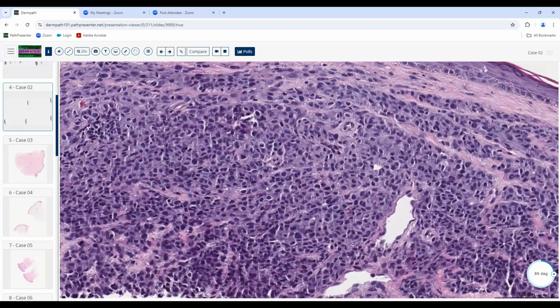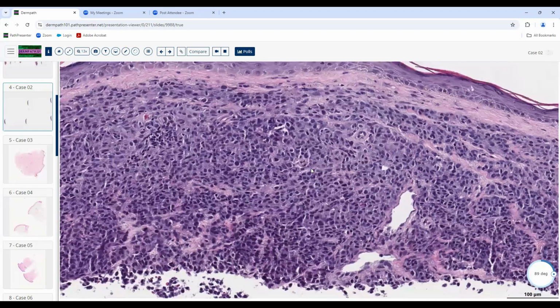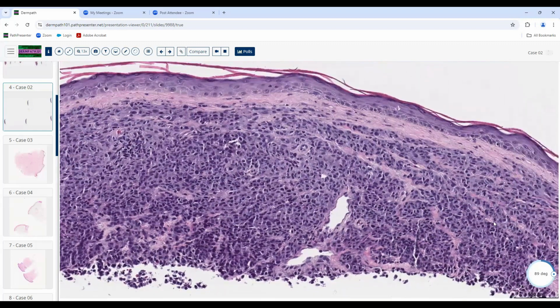Now, if it's melanocytic, because it's kind of poorly differentiated here, we might even say it's kind of epithelioid, and we might say, well, let's do some stains. Let's make sure it's not a pseudo-nested, pseudo-melanocytic breast cancer, for example, that spread to the skin. We see that on occasion. Pigmented metastatic breast cancer can simulate melanoma. So we've seen that, and so we might want to do some stains.